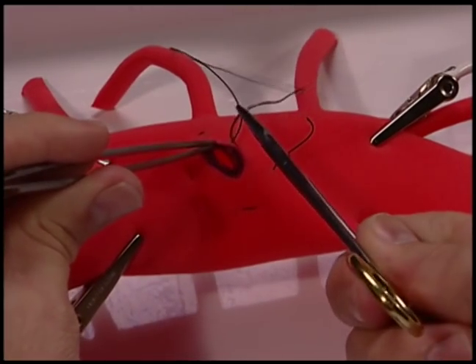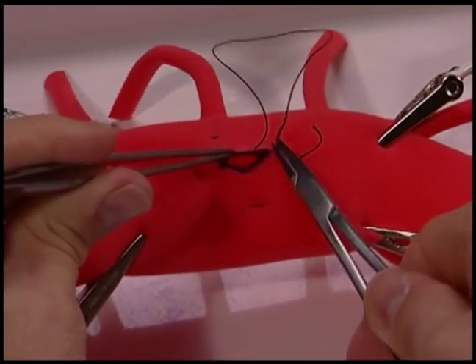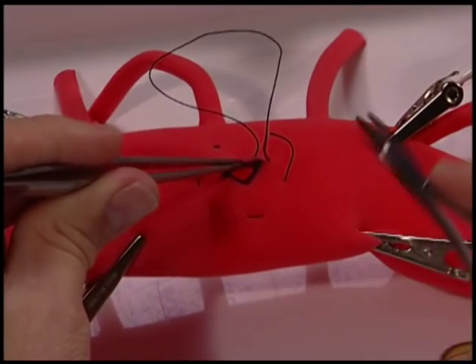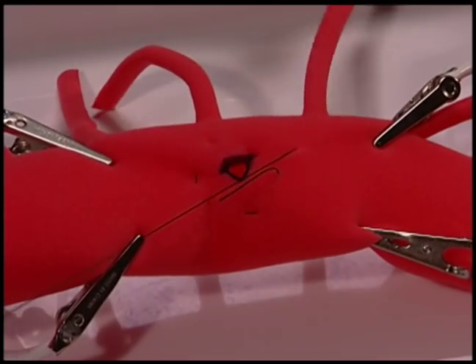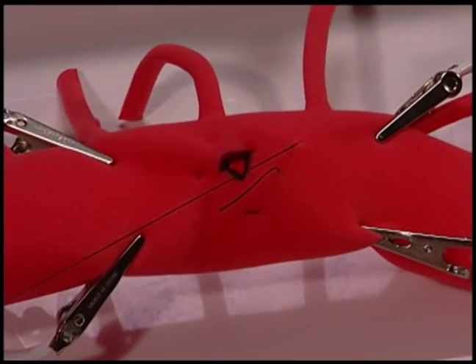Another common error is to bring the suture too far away. It's best to take nice, even sutures, allowing for a good closure of the defect.